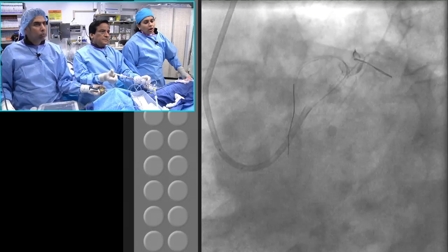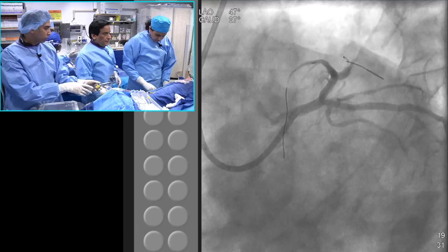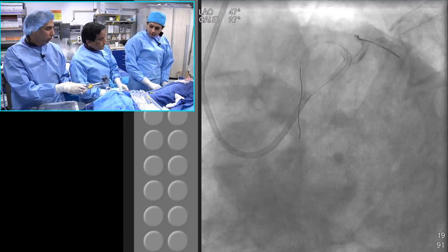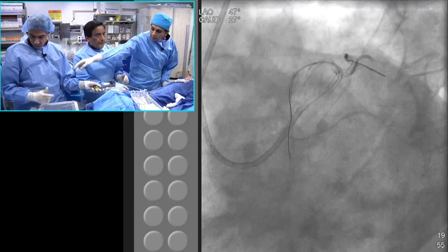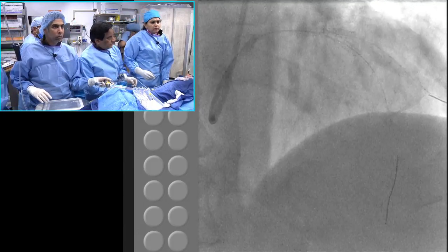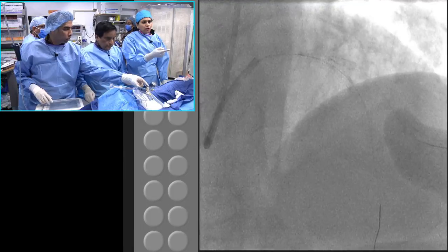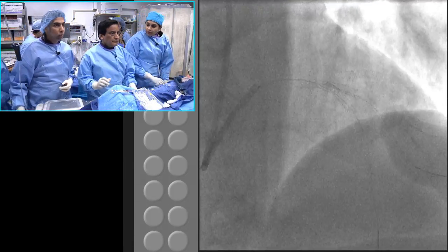Now, right now, all you need is vasodilators. Yes, so use nitroprusside, or before that, go cranial if you want. Let's get vasodilators, get the flow back before we go kissing. And a 3.0-15. Do I just do it from the guide? Did you use nitroprusside? Not yet. But before you give nitroprusside, when you have slow flow, you need a microcatheter to go distally. We have the Twin Pass.